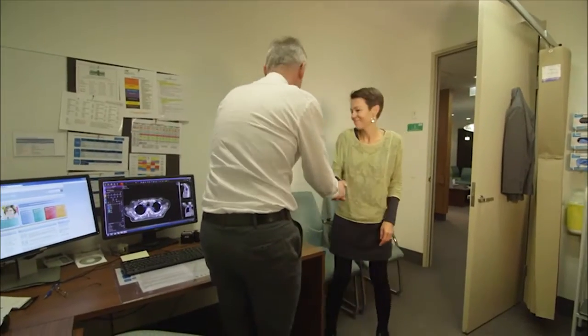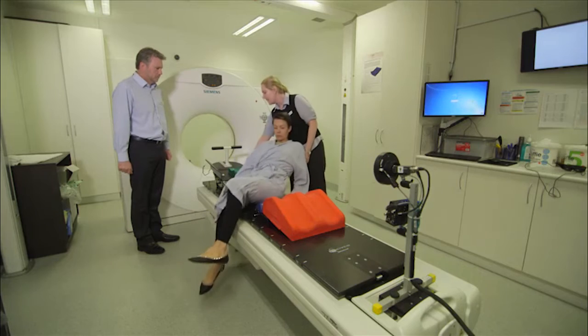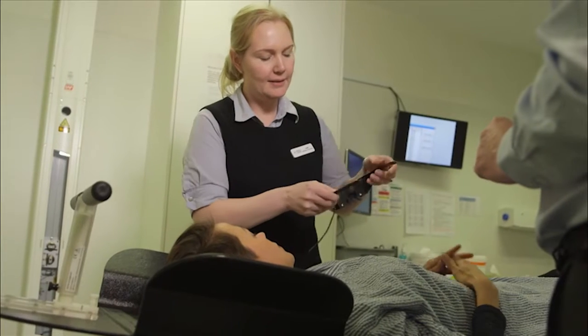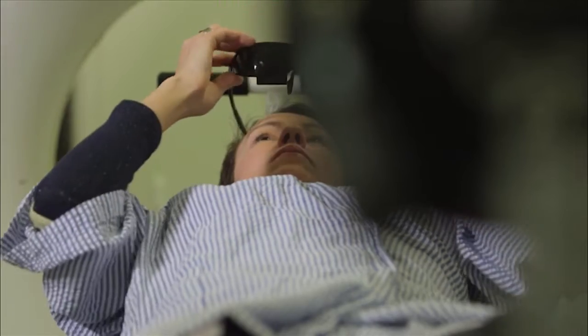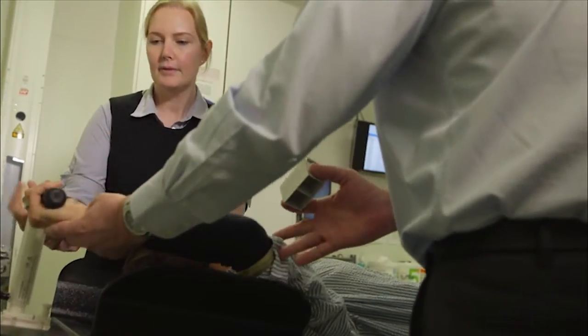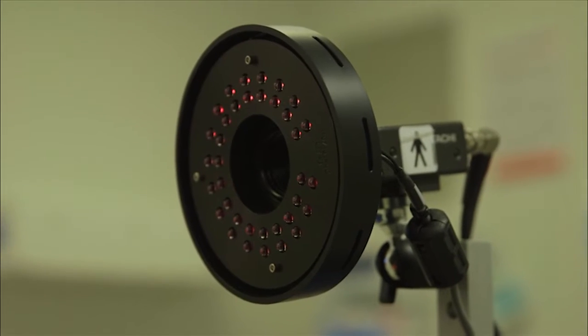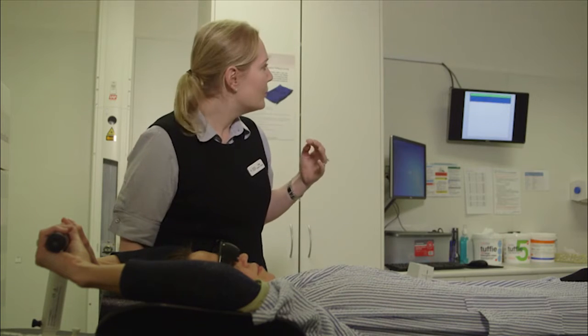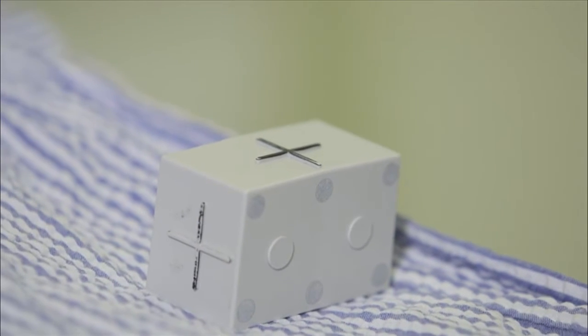Once your doctor has decided that you're suitable for DIBH, there are 3 steps in the process. Firstly, an education session where your radiation therapist will give you an overview of the DIBH technique and teach you how to hold your breath correctly. You're then scheduled to go in for what's called a CT planning scan, and this is where they take all of the measurements so that the measurements and the alignment is exact every single time.